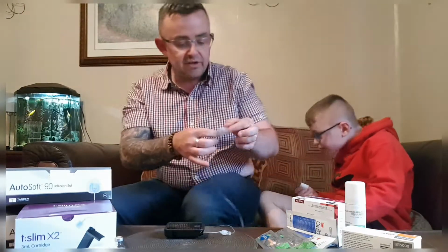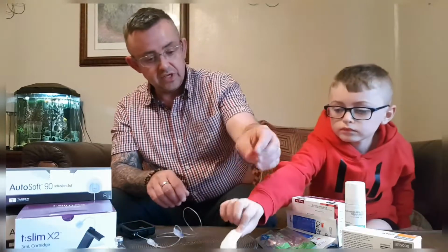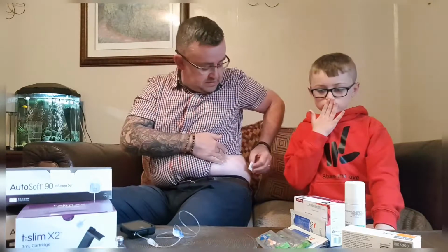Ew. So that's now disconnected from my body. You can then use this to clean the area up.